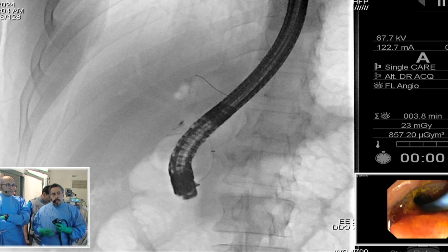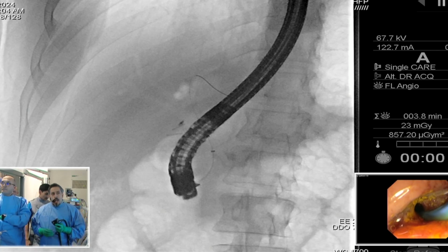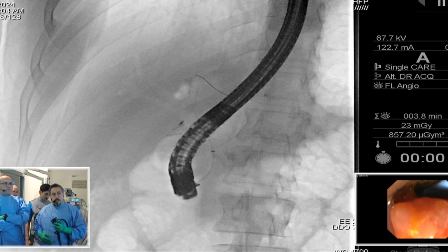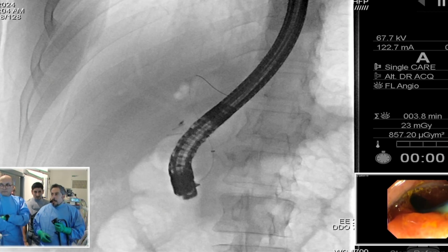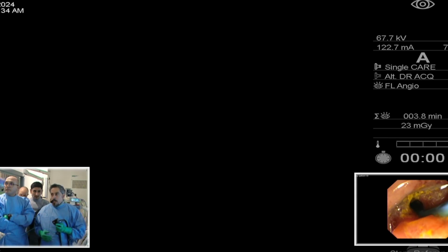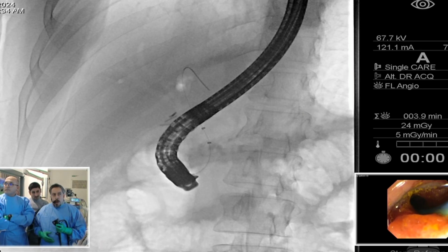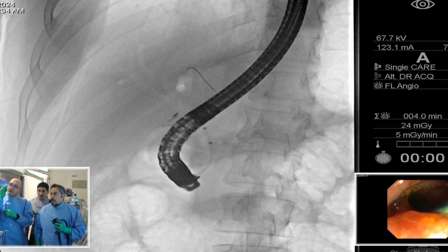I have a comment about that. I don't biopsy. And the problem is, if you write in your report stricture, you are scaring everybody. When anybody reads it, even a surgeon, they ask, is this a stricture, do we need to diagnose it? Is this a malignant stricture? So in the right setting, like this case, I don't like to call it stricture. I just call it tapered duct or narrowing of the CBD. I'm not going to call it biliary stricture.